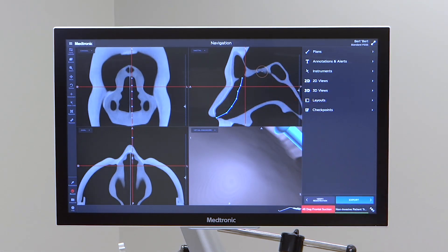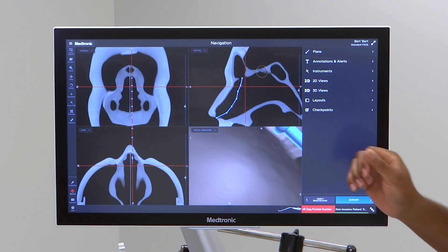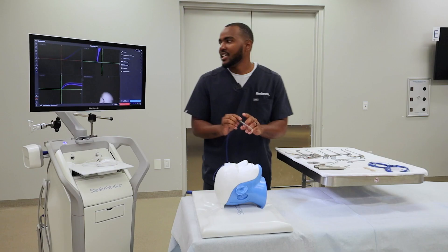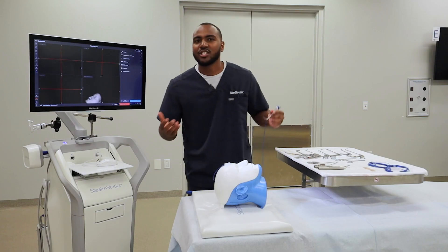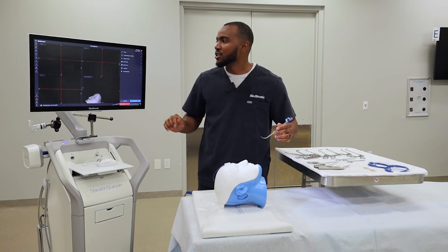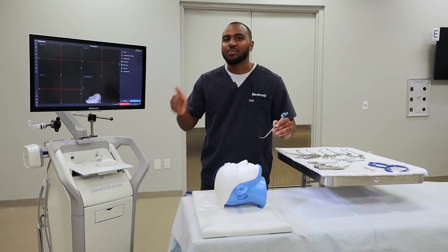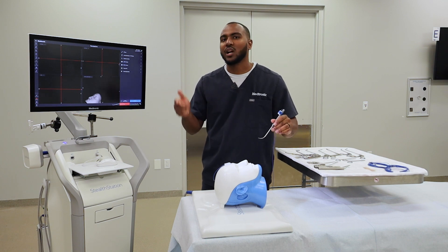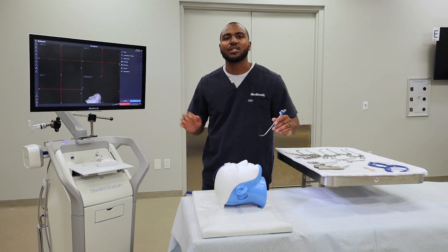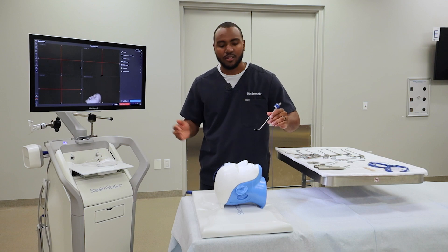The alert is perfect for marking critical structures. I'll now demonstrate with the virtual endoscope how the plan looks, as well as what happens whenever you get into an alert.